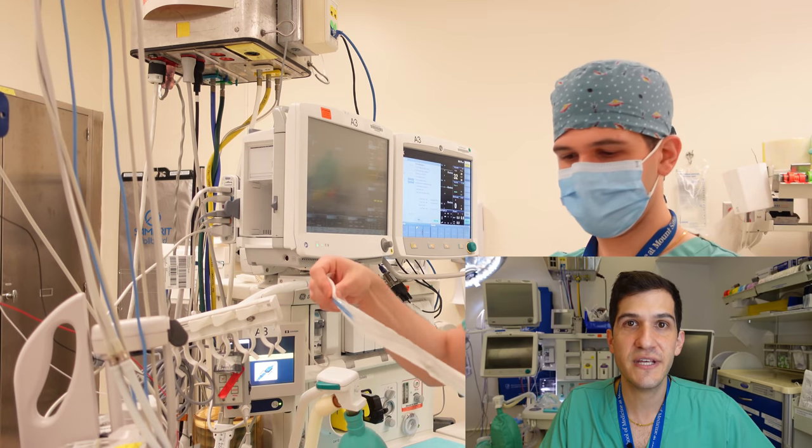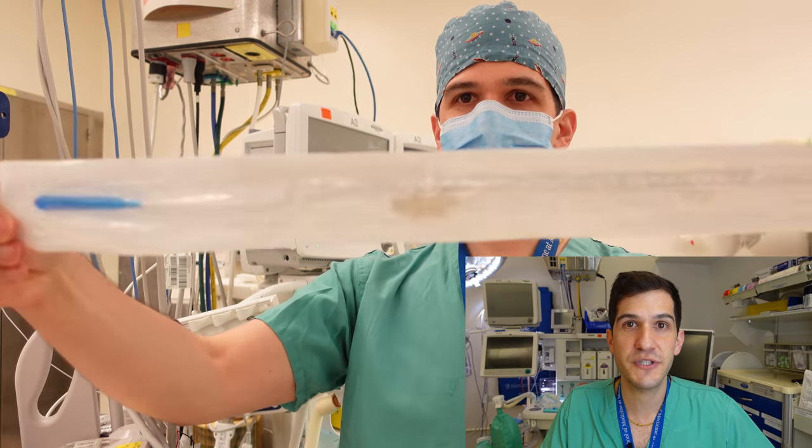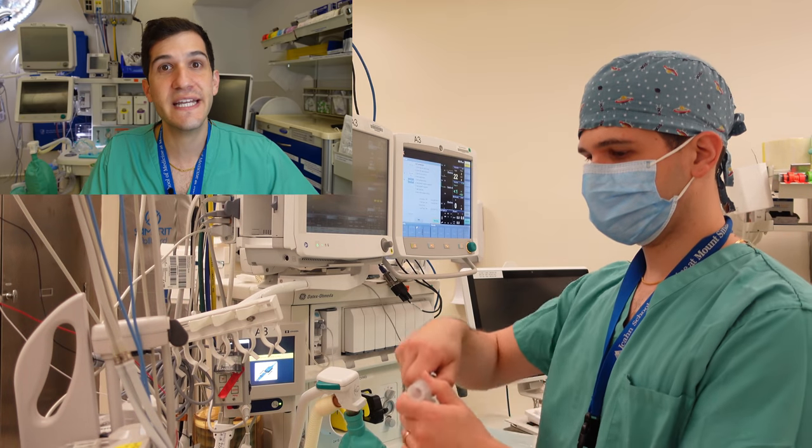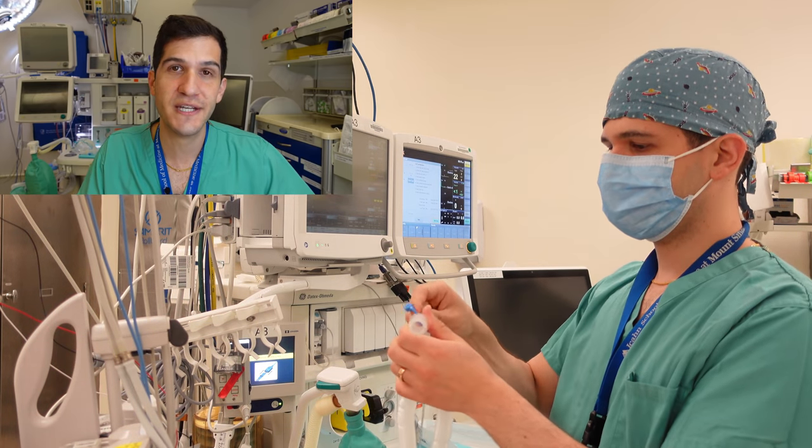I'm also going to have a thermometer ready to go — in this case I'm using an esophageal temperature probe which goes down the patient's esophagus. The last component of my monitor setup is making sure I've got my cable connected to capture end-tidal capnography, which refers to getting a sense of how much CO2 the patient is breathing off.